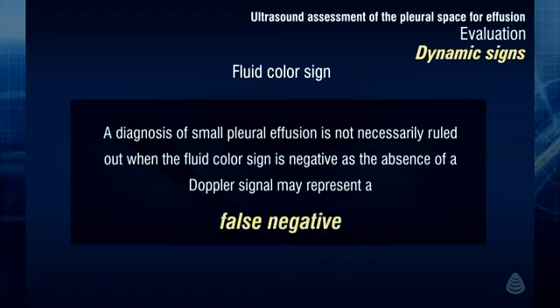As was previously seen in the curriculum on echocardiography and on vascular ultrasound, Doppler ultrasound can have many potential traps and pitfalls, and the operator using this modality needs to be aware of those pitfalls. These will not be reviewed again in this curriculum.